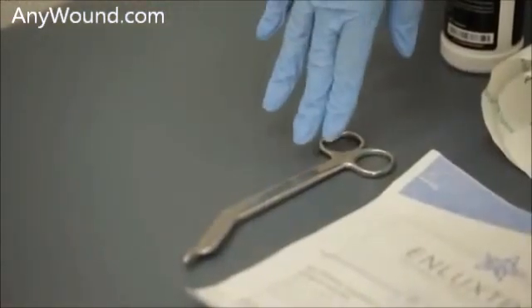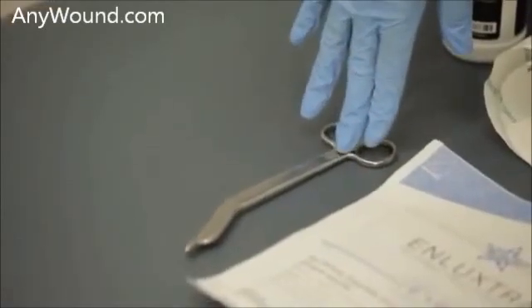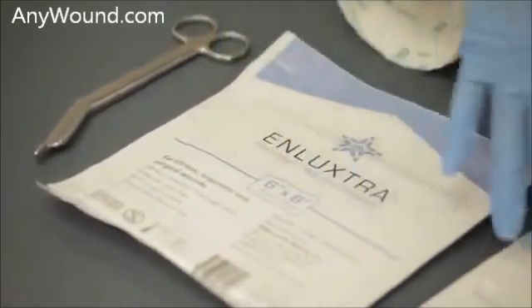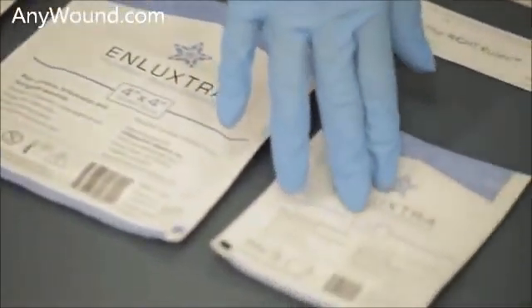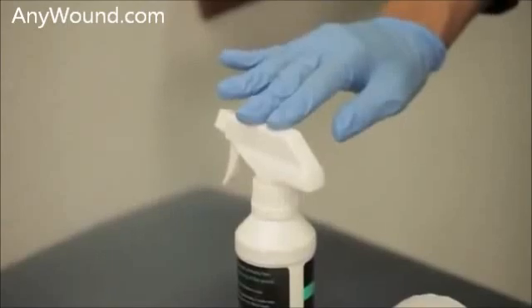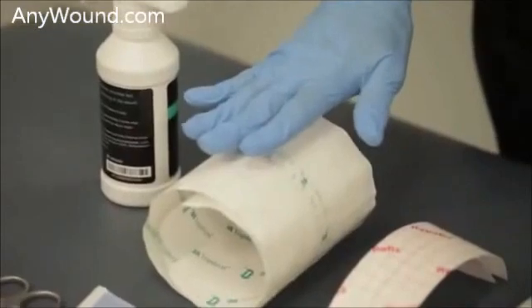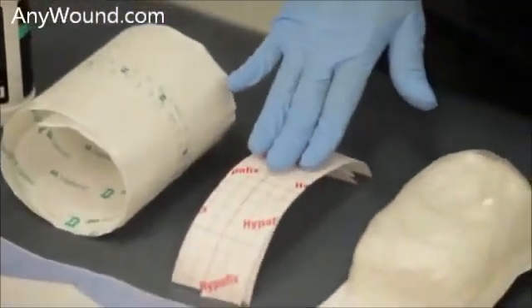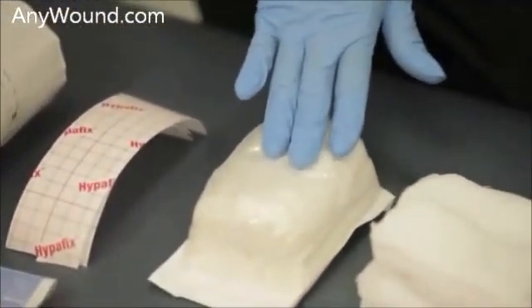These are some of the items that will be needed for applying Enluxtra: scissors; the Enluxtra in a 6x6, a 4x4, and a 2x2 size; a wound cleanser that will be utilized for cleaning the wound bed. There are two different types of securing it — you can use a transparent dressing or a cotton tape. It can also be secured with Curalex.